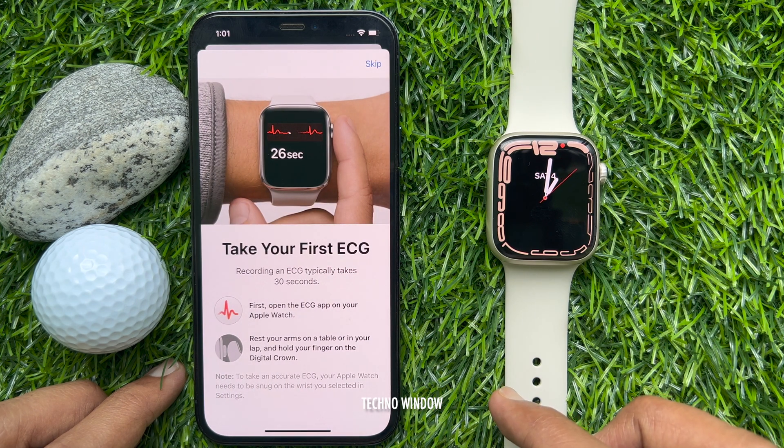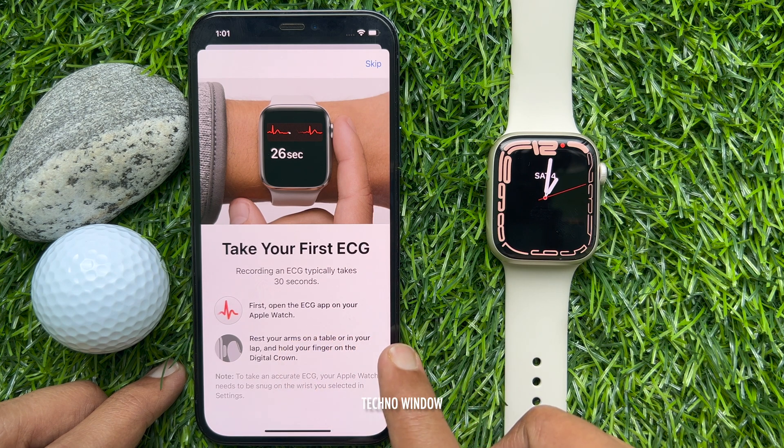That's it — ECG app setup completed. Now take your first ECG. Recording an ECG typically takes 30 seconds.